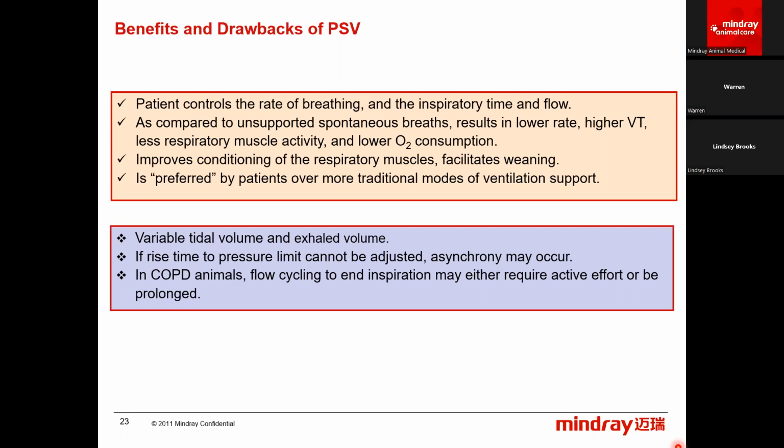One of the drawbacks, though, is that you do end up with a variable tidal volume and exhaled volume. So if you are trying to reach a certain tidal volume, just to maintain your patient's compliance, pressure support might not be the best choice.